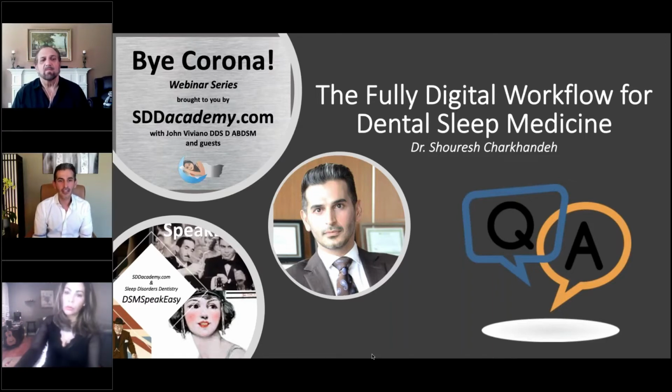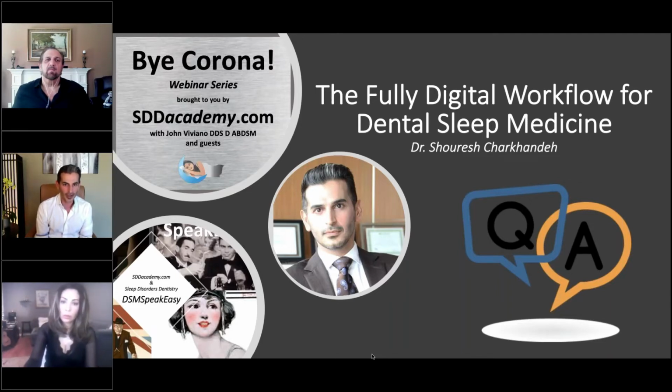The question is, what is volumetric analysis invalid for? We know the volumetric analyses being done are actually very accurate in measuring the actual size of the airway. But whether or not they have any meaning in terms of predicting oral appliance therapy, as I mentioned in my talk, it does not have any validation as of today. So we cannot predict treatment outcome by looking at volumetric.